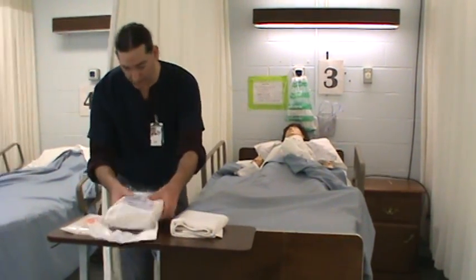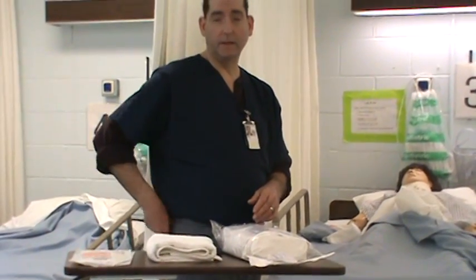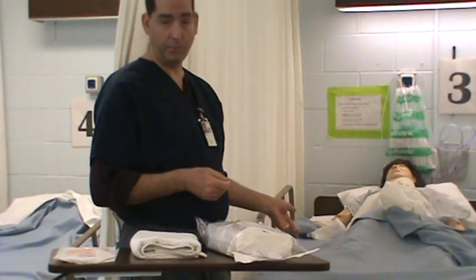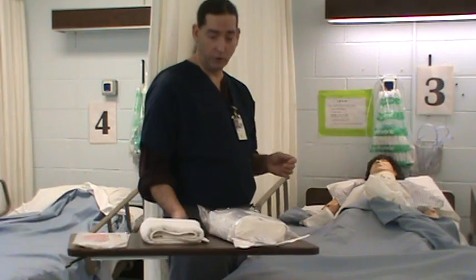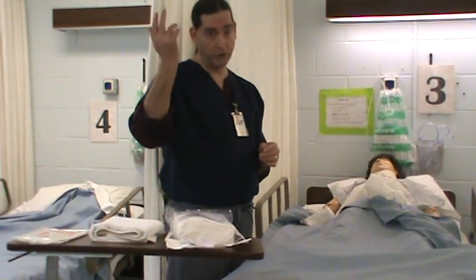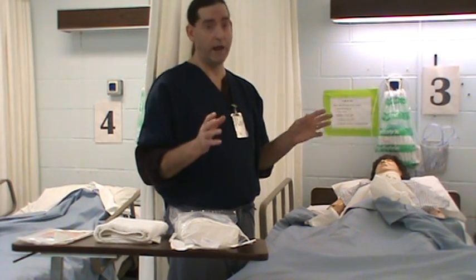I'm going to get my catheter kit. I'm allergic to the latex gloves, so I always have my non-latex gloves. I always carry a spare set in my back pocket because sometimes I will mess up — put a glove on wrong or touch something on accident. People can have their hospital stays increased if they have urosepsis from an improperly placed Foley catheter. Sterile field is the main thing. That's why when you come to check-off, you better pull your hair back because if you're brushing a wisp away, there's going to be problems. Try to present yourself as if you're coming to a clinical.